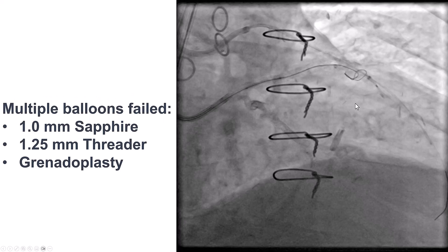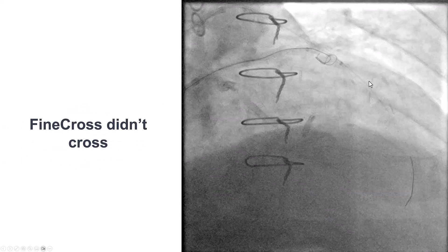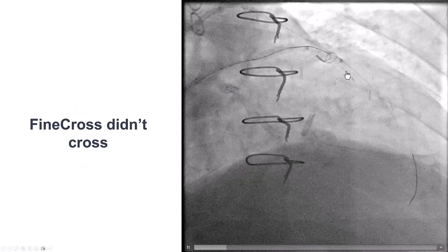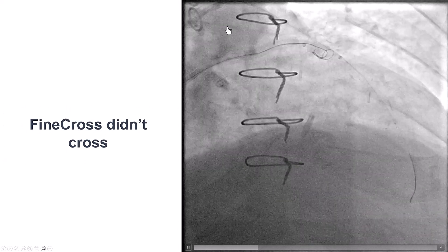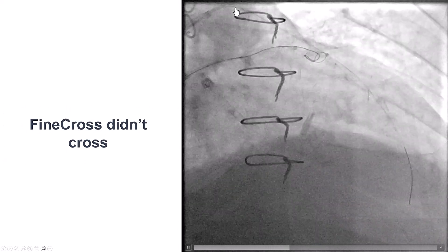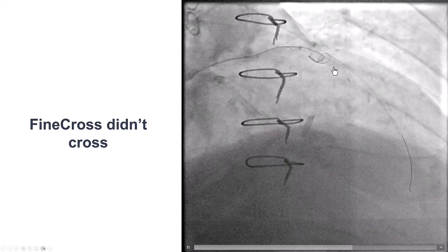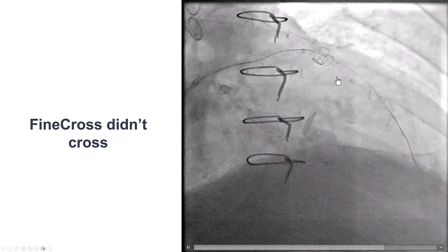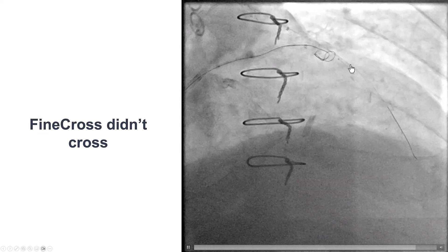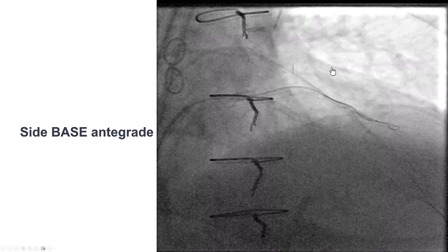We now had a microcatheter uncrossable CTO. We tried different things — small balloons: 1.0 Sapphire, 1.25 millimeter Threader. We even inflated the balloons until they ruptured, but it didn't work. We had good support with a guide extension in the retrograde guide, but even when we used a different microcatheter — a Finecross — we just could not get through this area.